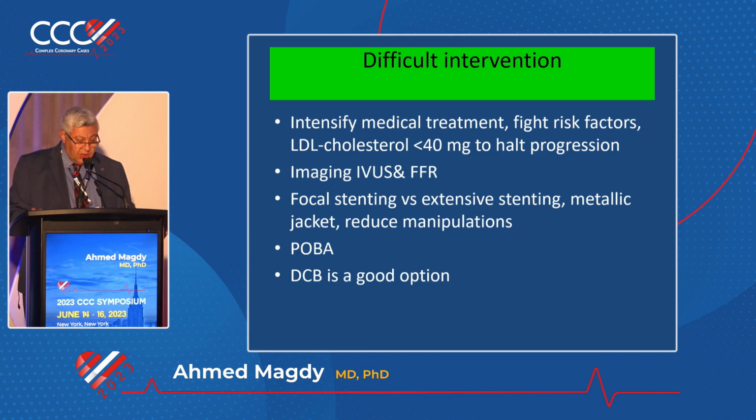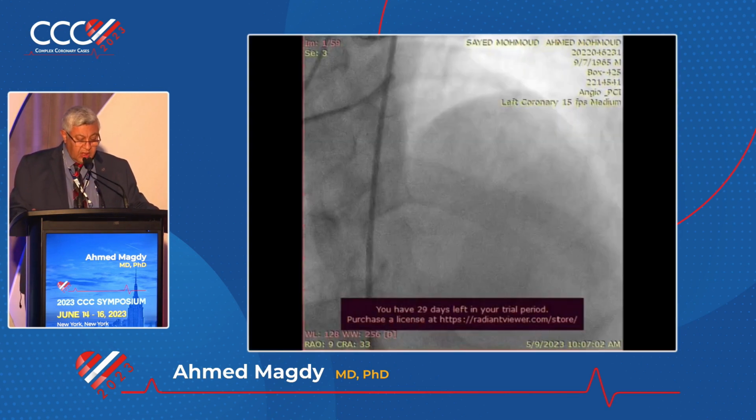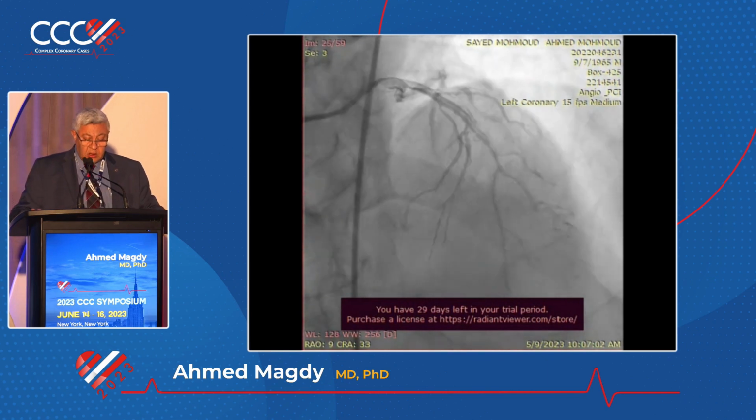What are the options? To intensify medical treatments, to fight risk factors, using imaging, maybe focal stenting rather than extensive metal jacketing of the arteries, maybe balloon angioplasty, and recently the drug-coated balloons, we are using that, the several developments.